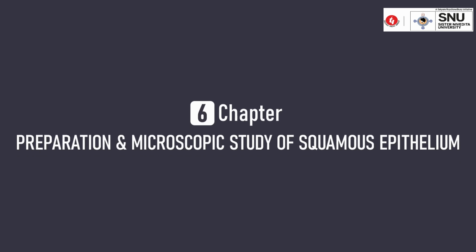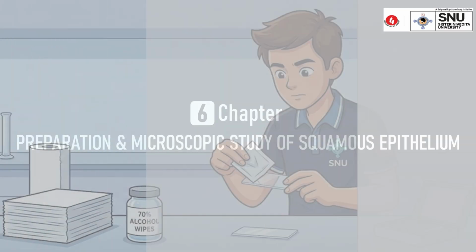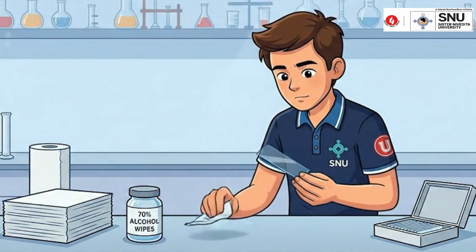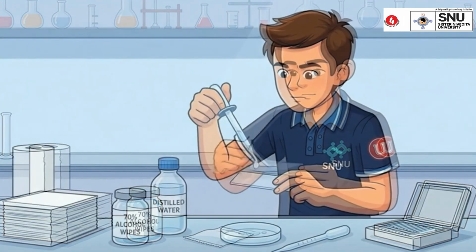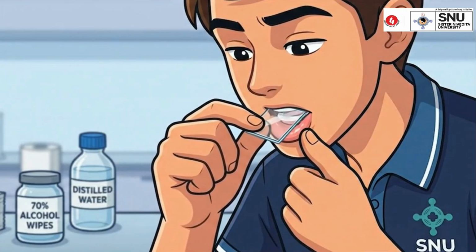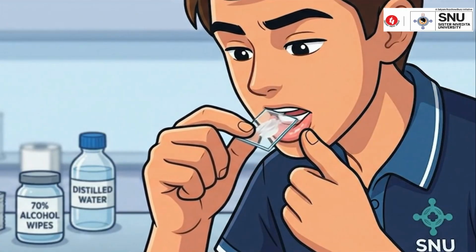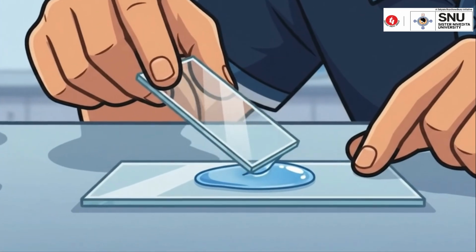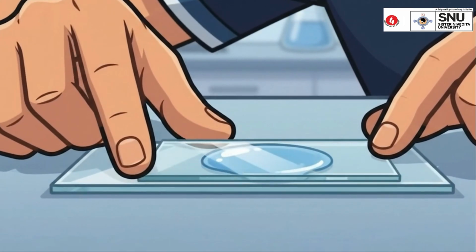Next, we will learn the procedure for preparing a squamous epithelium slide before watching it under the microscope. First, take a clean slide and remove grease by wiping it with 70% alcohol. Add 1 drop of distilled water on the middle of the slide. Now gently collect a sample by scraping the inner surface of the lip with the cover slip. Place the scraped sample in the water drop on the slide.